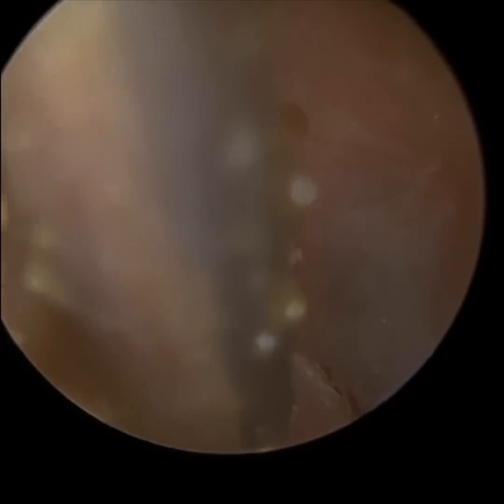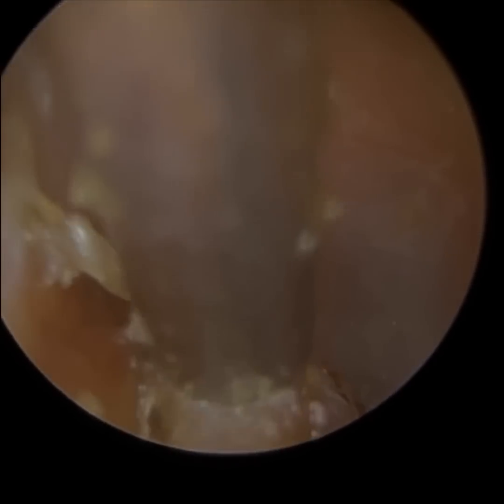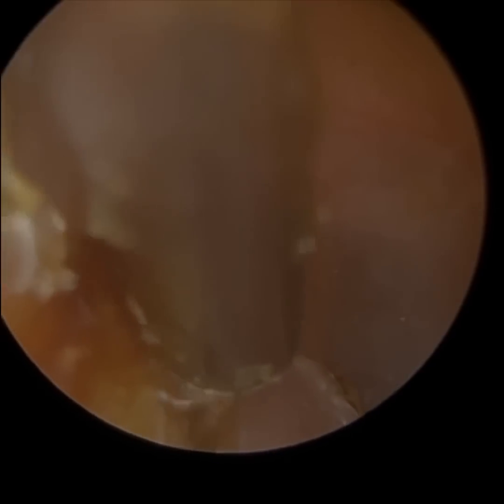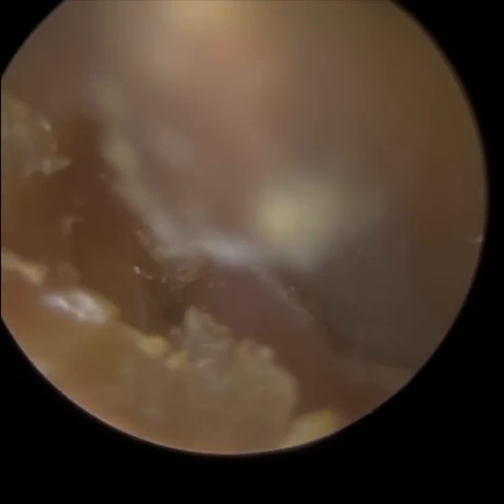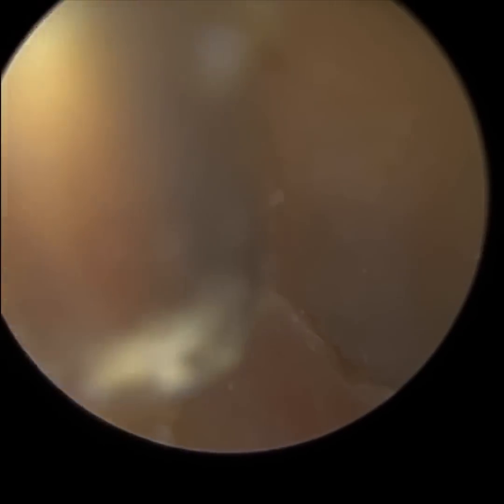And this is one of the advantages of the endoscope. We've got such a wide field of view that I'm able to see regions of the ear like this that I typically wouldn't with a microscope or an otoscope. And once more, it's quite close up because at this bit it's right near the entrance, so I have to put the endoscope in the ear, otherwise I wouldn't be able to see inside the ear. And by virtue, if any wax is near the entrance, it's going to be close up.